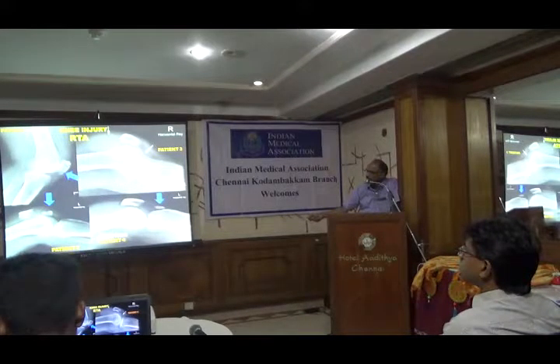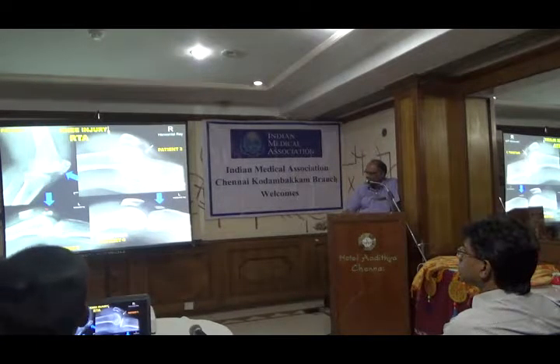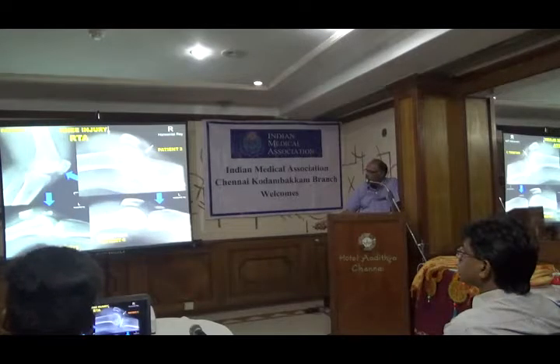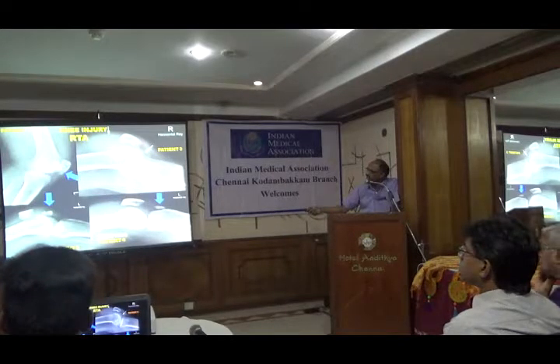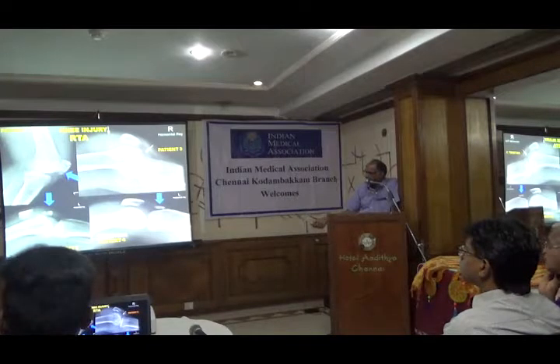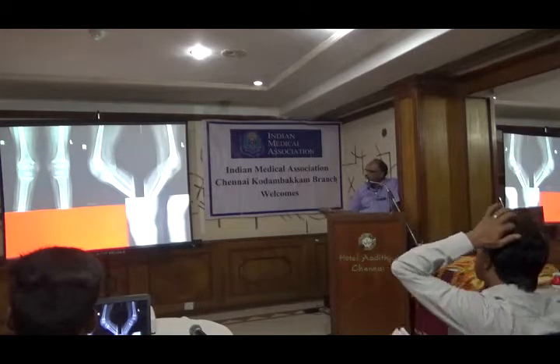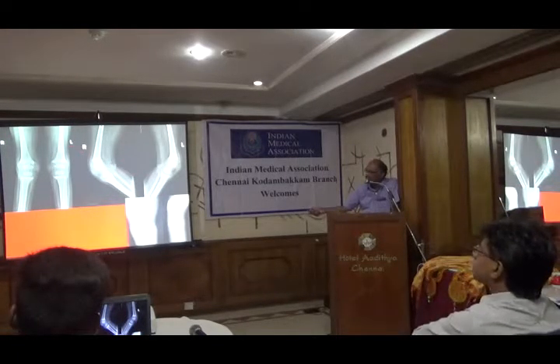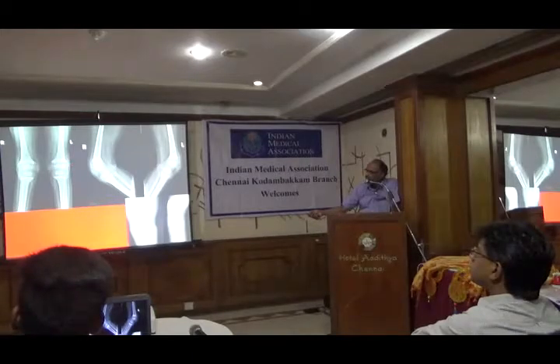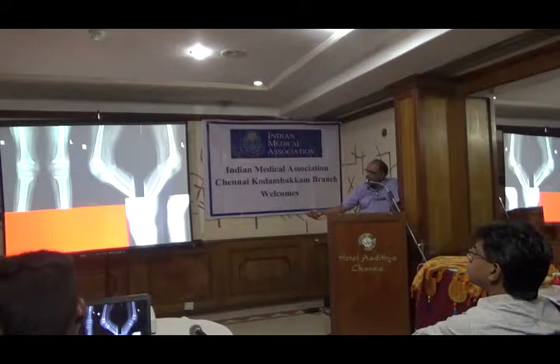The knee is the commonest site where you see patella fractures. This is a patient where multiple fractures of the patella are present, and the joint space between the patella and the femur has been reduced. In the lateral view, you can see the patella has been broken into pieces, there is an effusion, and a bipartite patella is also seen.